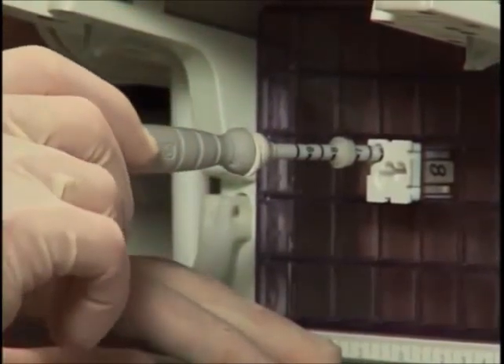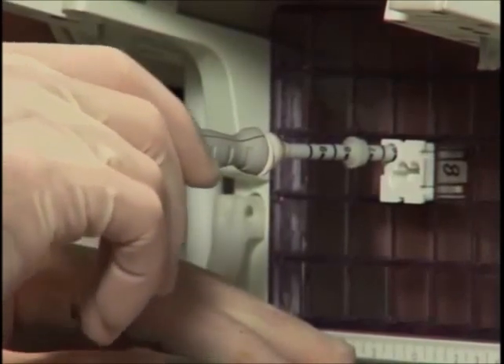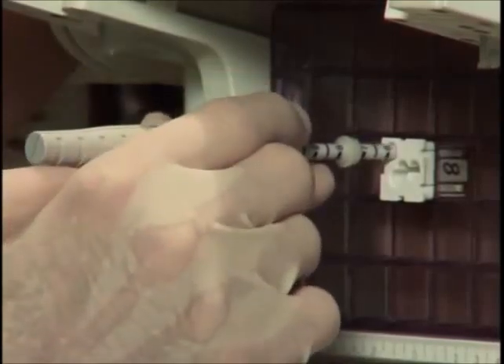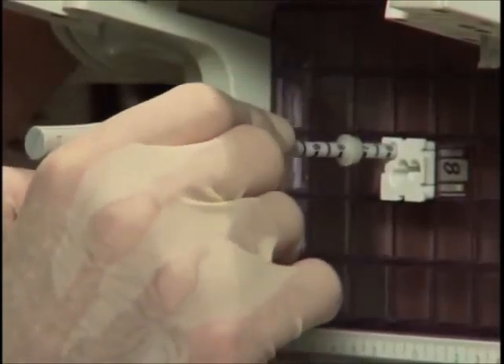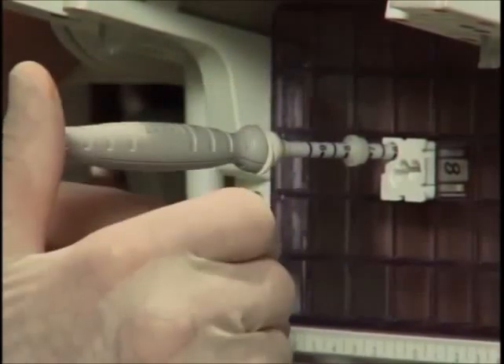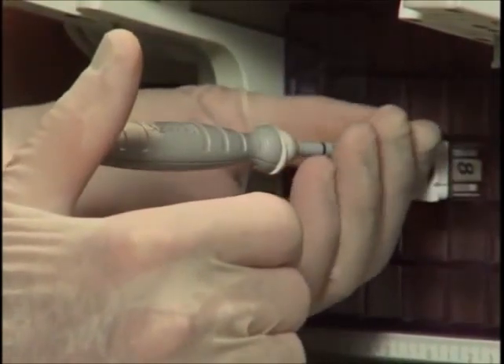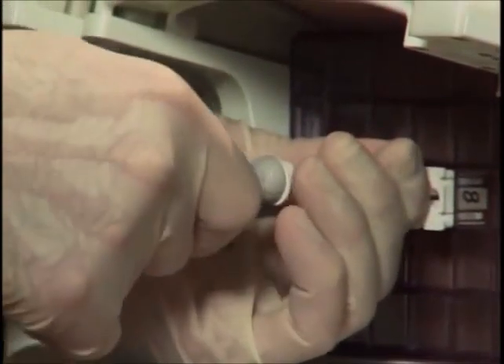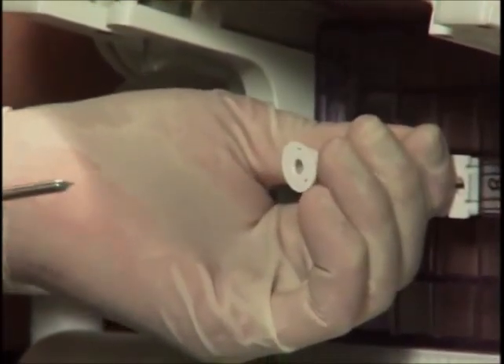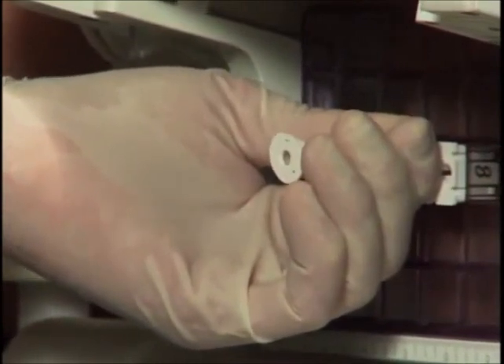Once you've reached that depth, just rotate the trocar slightly. Sometimes there'll be some additional recoil of the breast tissue and you may be slightly shallower than you think, so make sure there's no more recoil and that you're then at the depth you planned. Having done that, grasp the sheath, pinch it, and rest your fingers against the block. Then remove the trocar. This prevents any inadvertent movement of the sheath and therefore losing your depth mark.